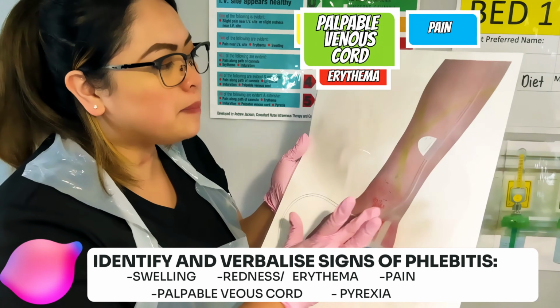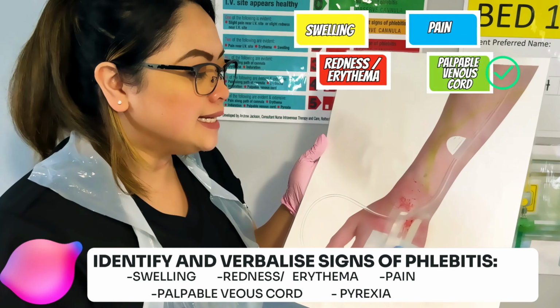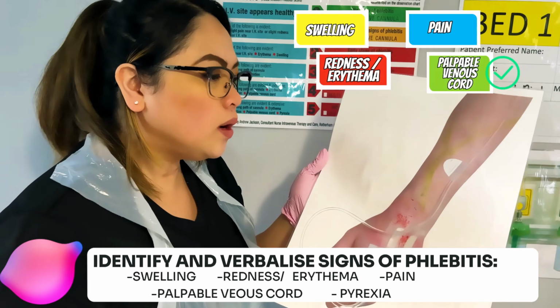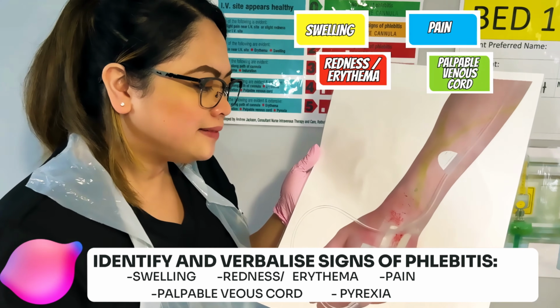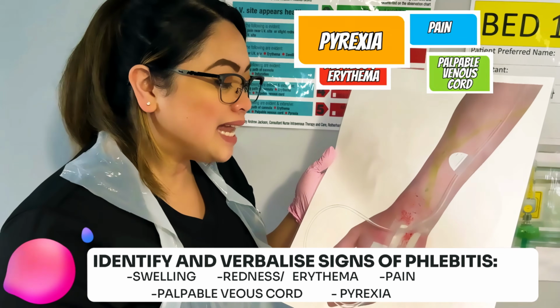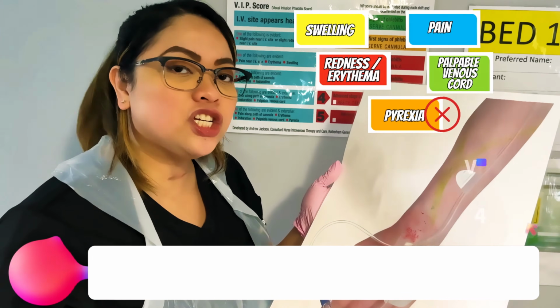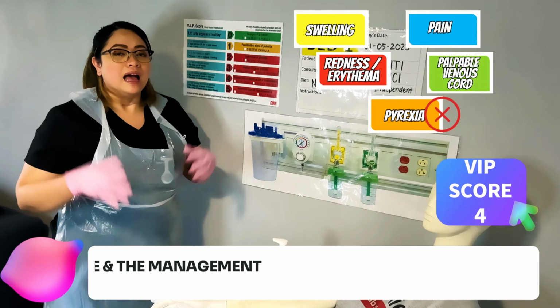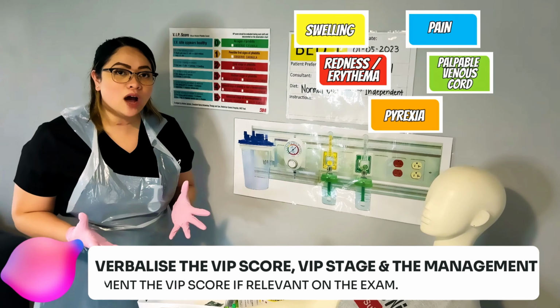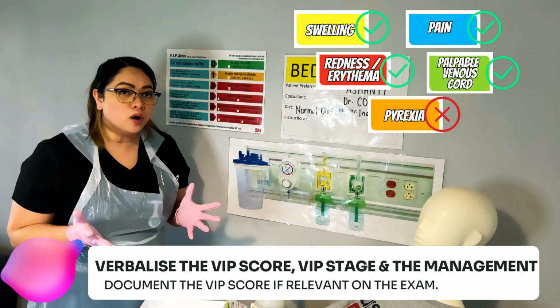Okay, can I just ask? I can also see a palpable venous cord right here. So I just need to ask, Miss Examiner, what's the temperature of the patient? 36.5. So 36.5. The patient doesn't have any pyrexia. So I can confirm that the VIP score of the patient is 4. That being said, this is now an advanced stage of phlebitis or the start of thrombophlebitis.